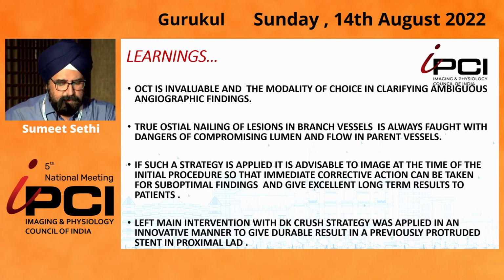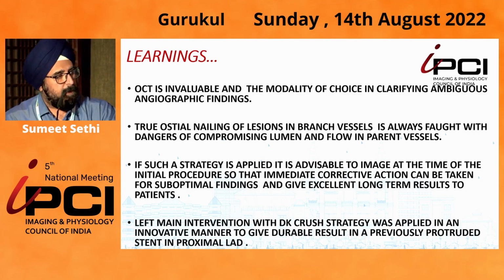And in this situation, left main intervention was done with a DK crush strategy in an innovative manner to give a durable result in a previously protruded stent in the proximal LAD.